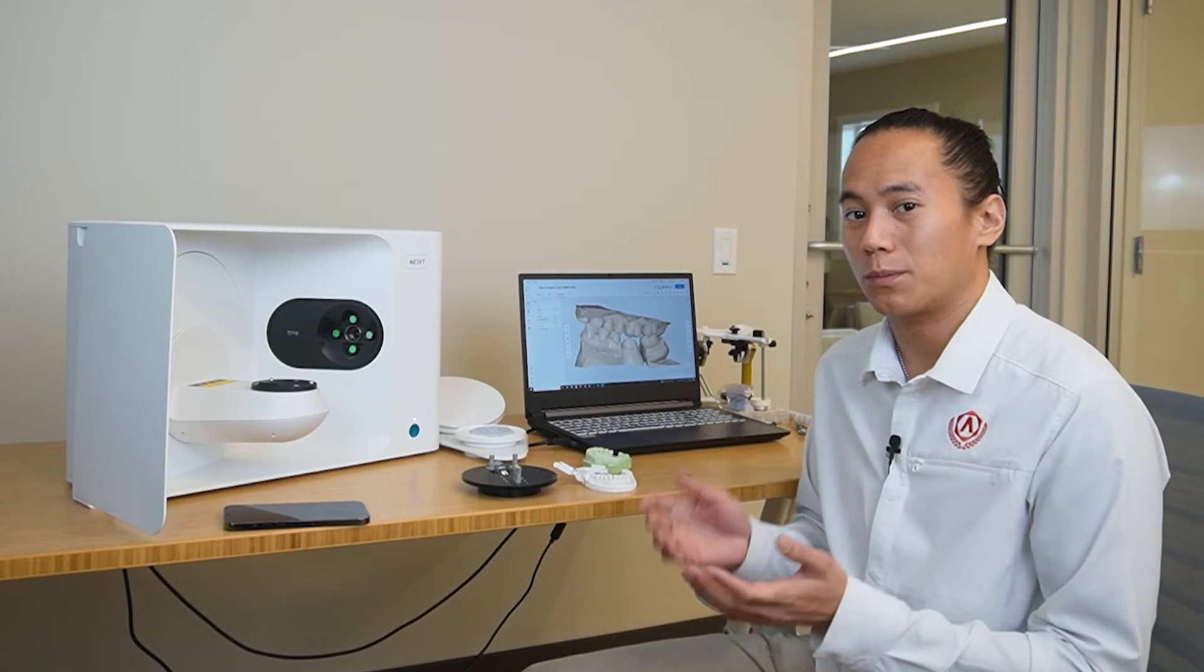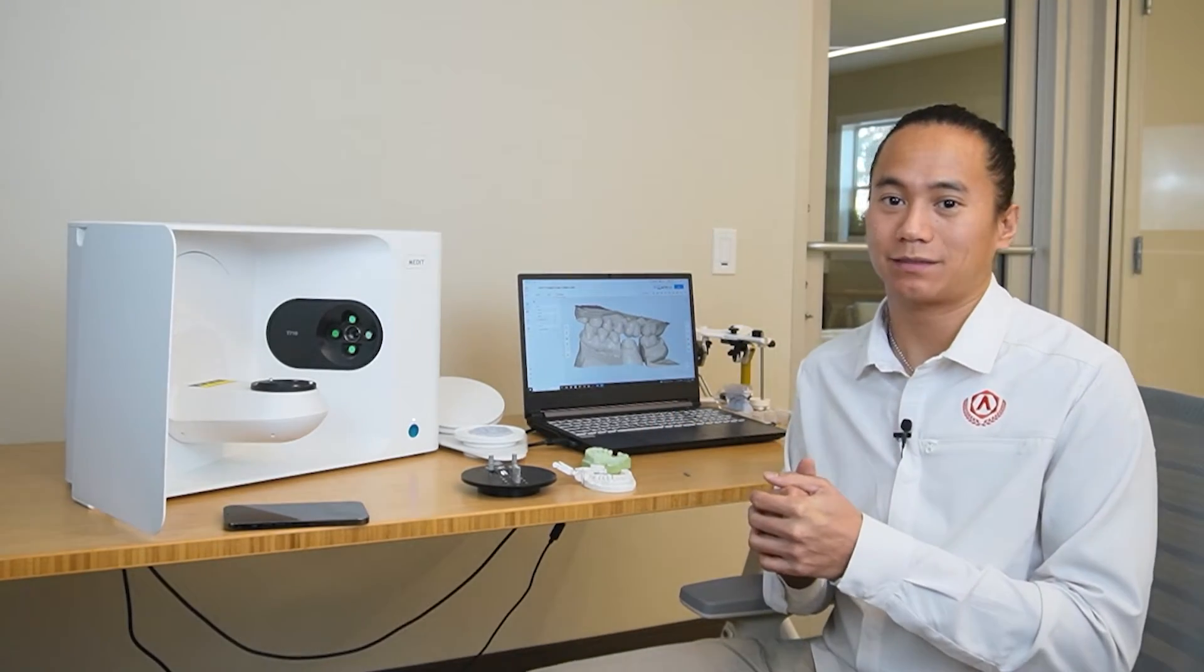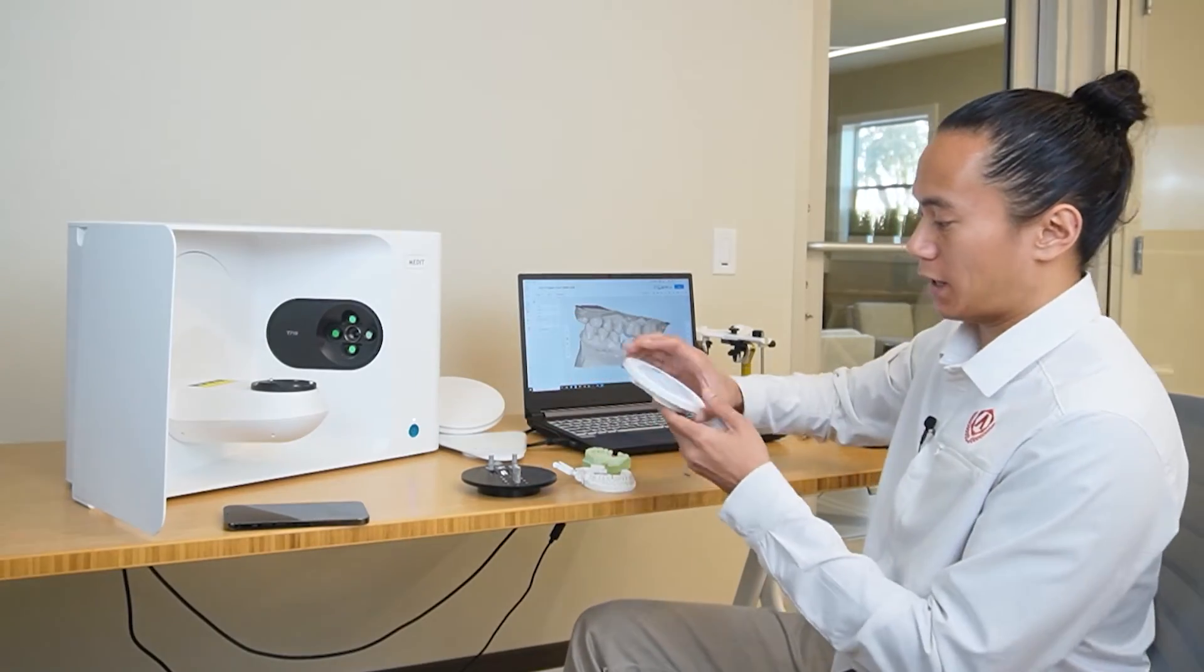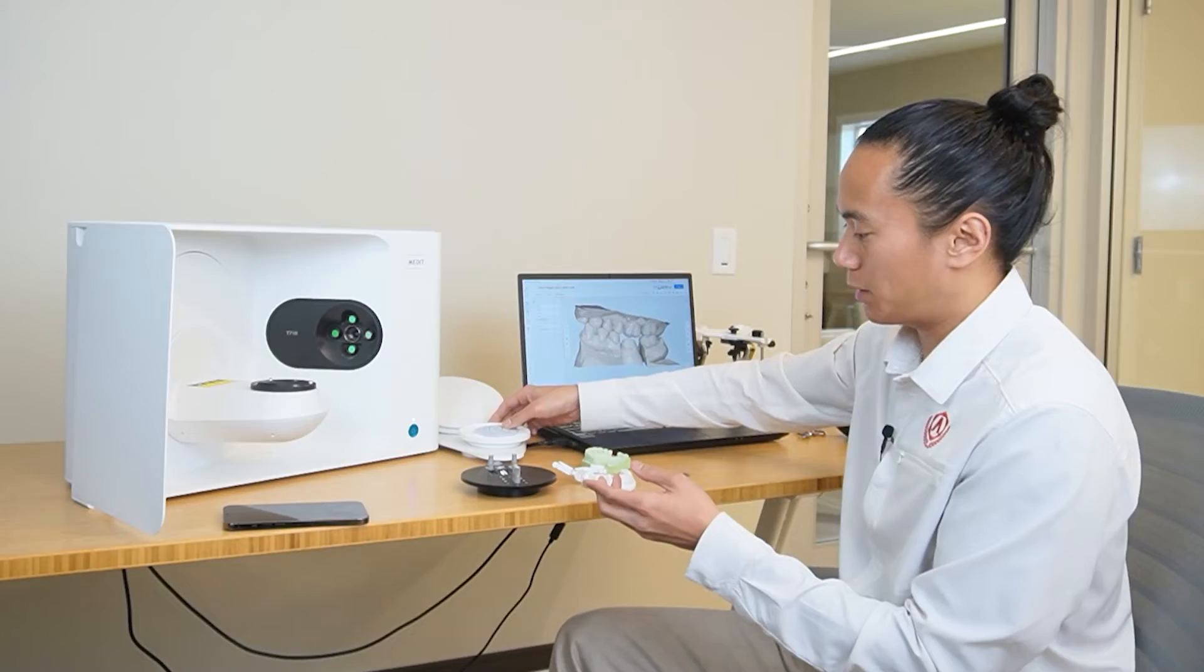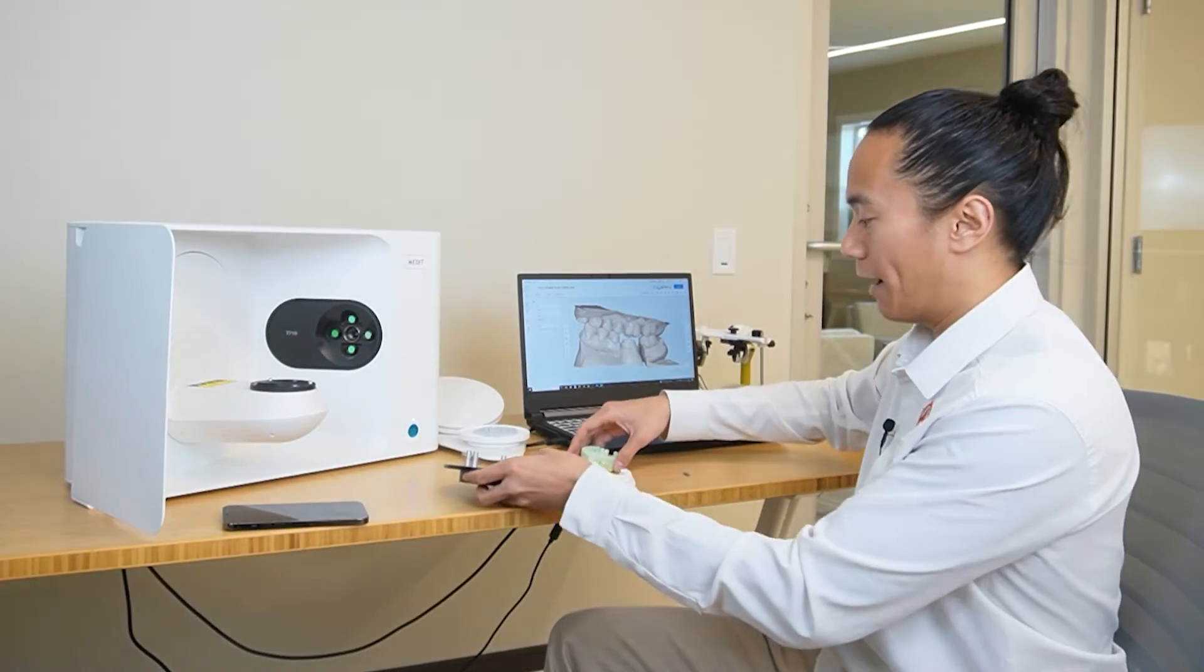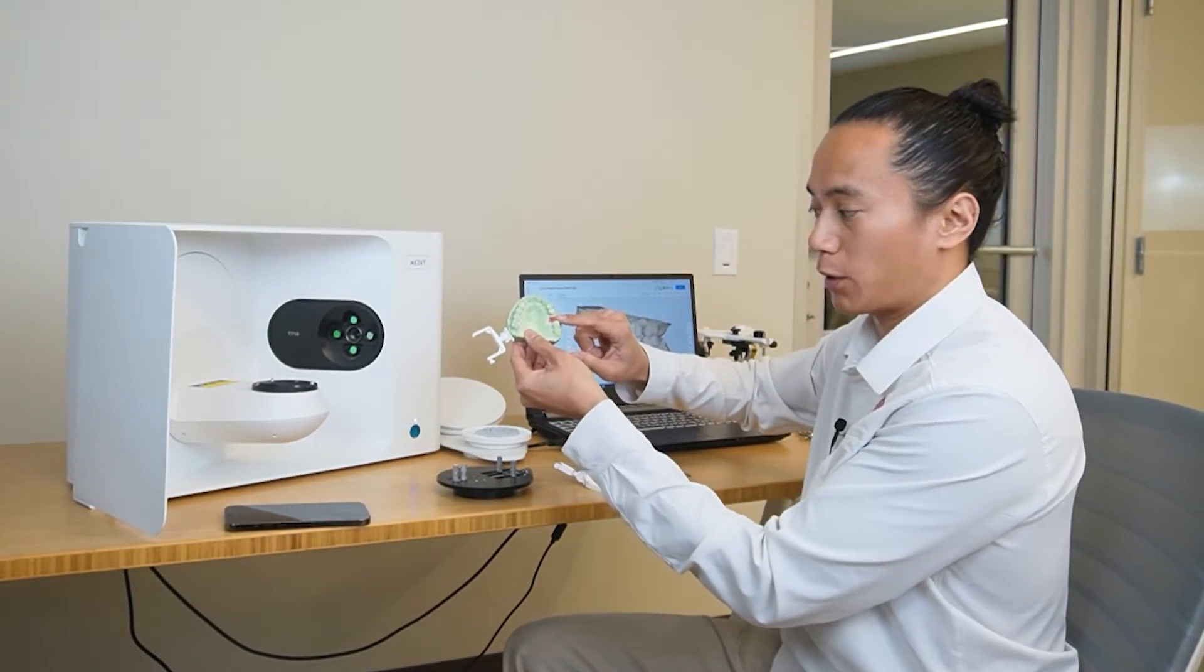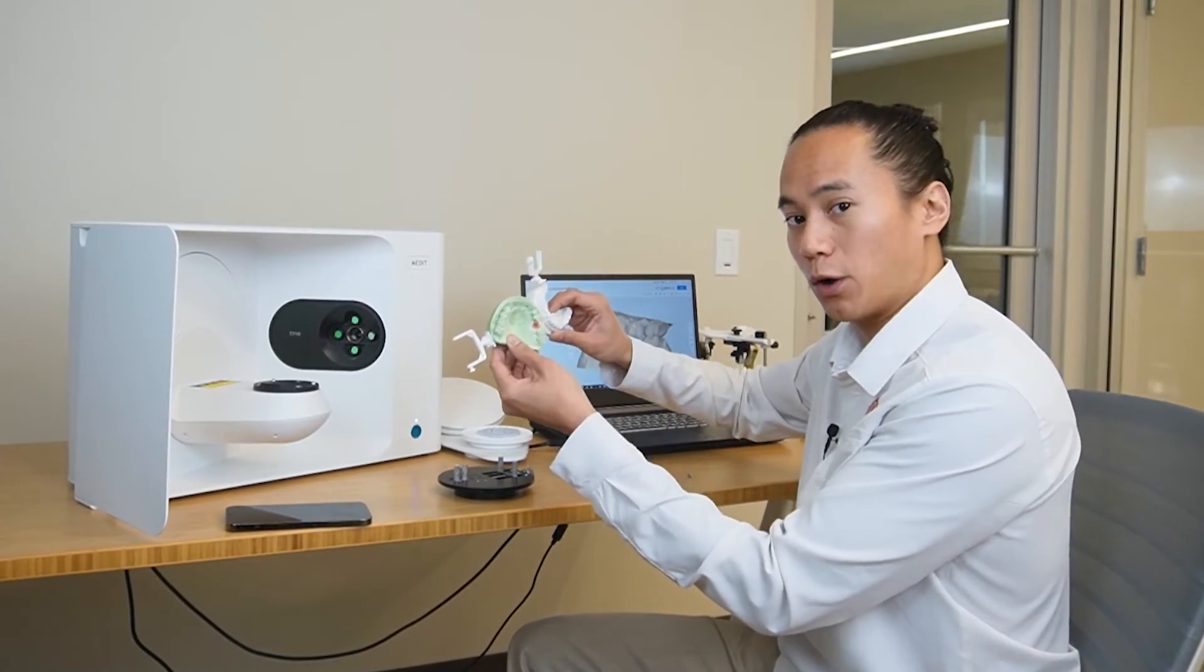All right. So we're also going to be covering over how to scan an implant case today. Unlike the die prepped case, we're not going to be using the flexible multi-die. We're actually going to be using the clamping stage. This one is beneficial when we have full arch models like this. Even though we're only going to be working on a single unit implant, we have both upper and lower full arch models.